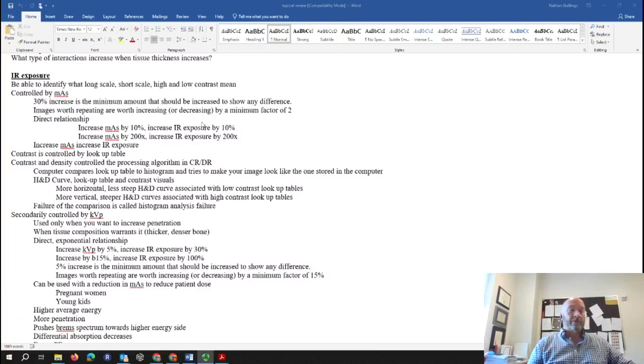Some index numbers will go up whenever you increase your exposure. In my personal opinion, there should be some sort of industry standard on that, but there is not yet. So double, or change by a factor of 2.